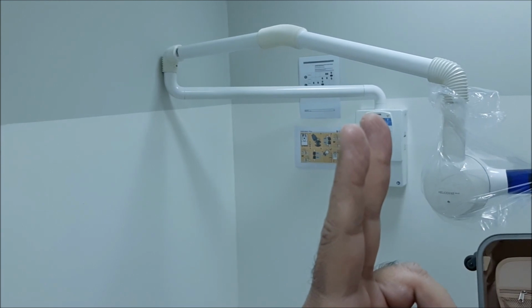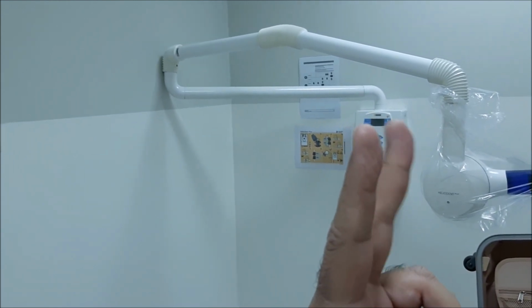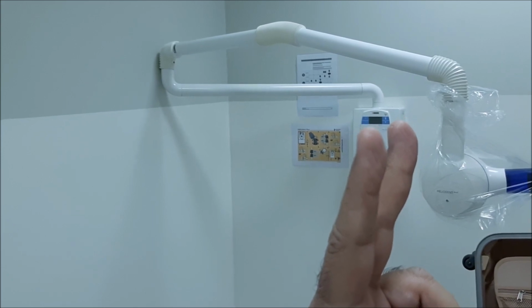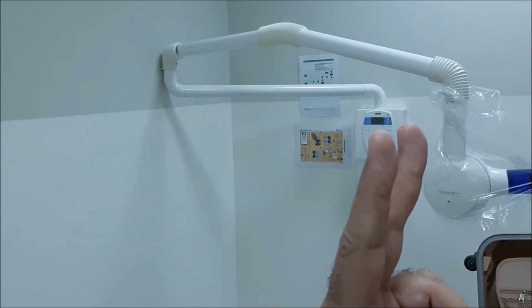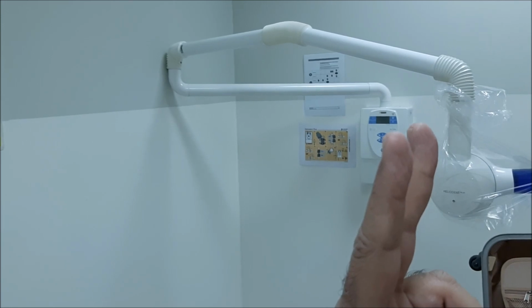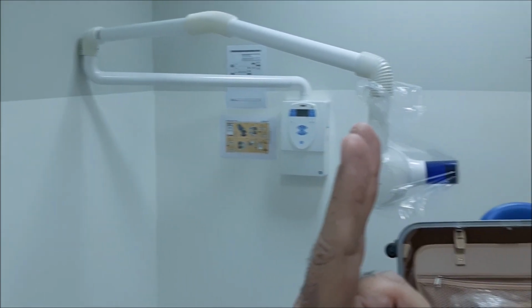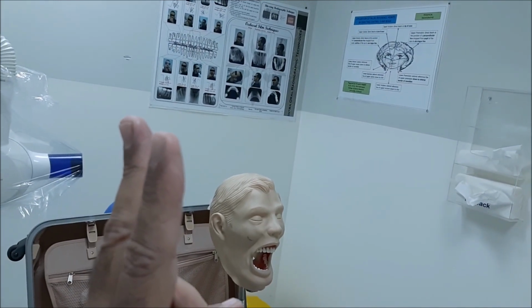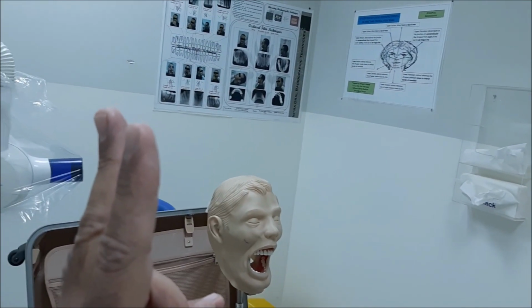See, when I move the camera, the finger which is away from me, in this case the palatal, will move with the camera. Again, I'll come from this side, and from the other side.